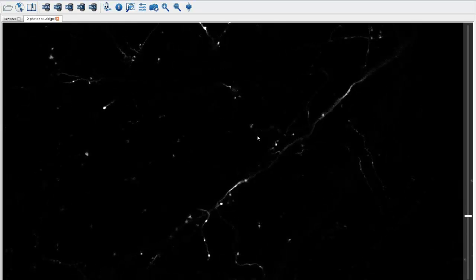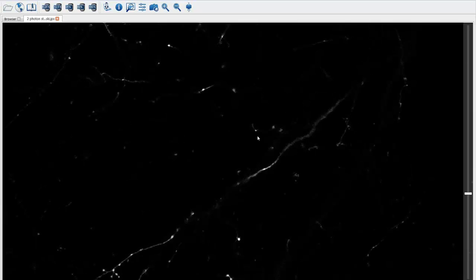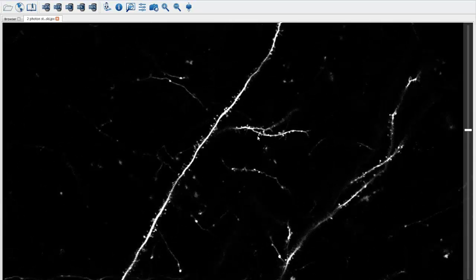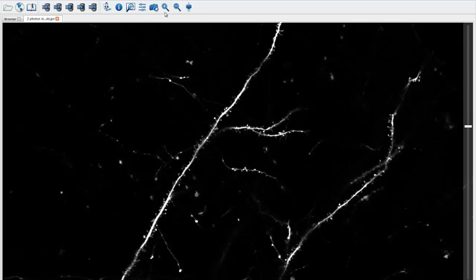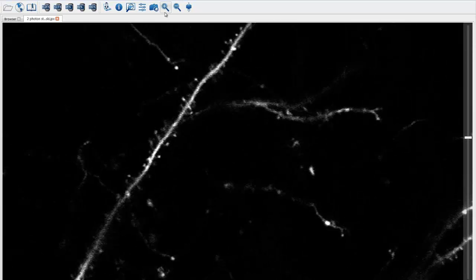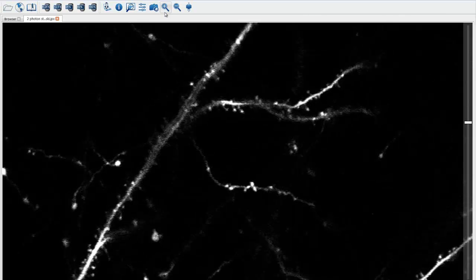Biolucida Cloud easily stores very large files, allowing you to view any region of your tissue, at any depth, and at any magnification, anywhere in the world. Sharing your digital slides over the internet with colleagues, students, or educators allows an off-site colleague with MBF analysis software to access an image from the cloud and perform stereology or trace neurons.